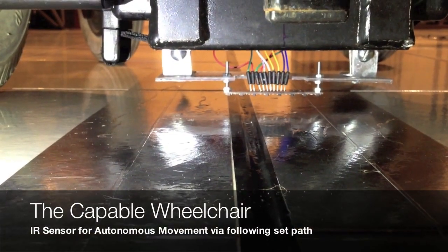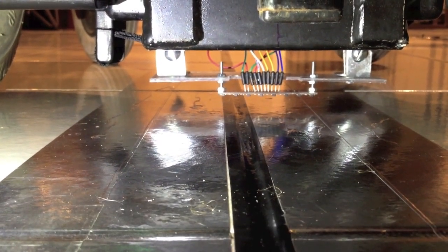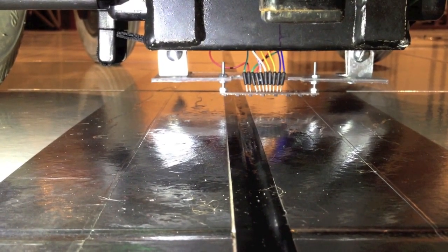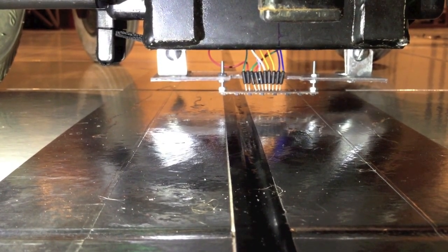You're looking now at the most important component of the wheelchair, which is what makes the wheelchair go from point A to point B at a given time. How this works: it sends infrared signals to a path that's been preset on the ground by code that goes into the Arduino, and then it goes to the motors to power up the DC motors that give the wheelchair the movement.